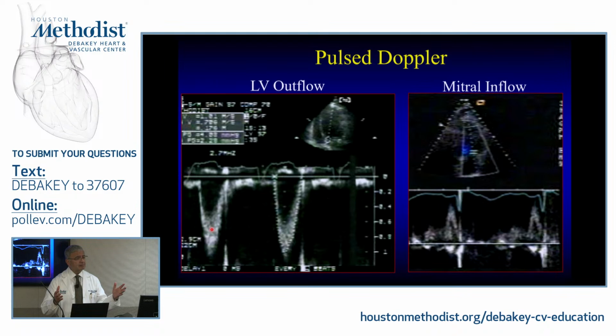Same thing when you go, I don't know if you go nowadays, post-COVID, to discos, etc. I know some people right here on the right side are party goers. So you go to a disco, and here you go, you have the strobe light, that's the same. That's your pulse repetition frequency. And at times you may not be able to tell whether the person is going forward or backward because the flash is not fast enough. So your limitation is your pulse repetition frequency for you to be able to solve particularly the high velocities, right?